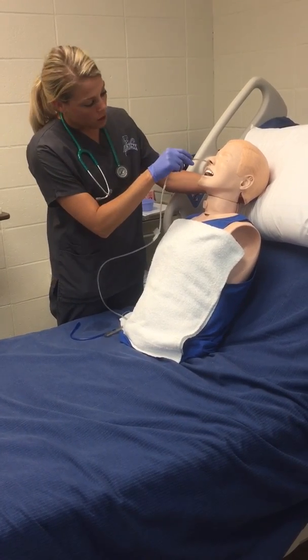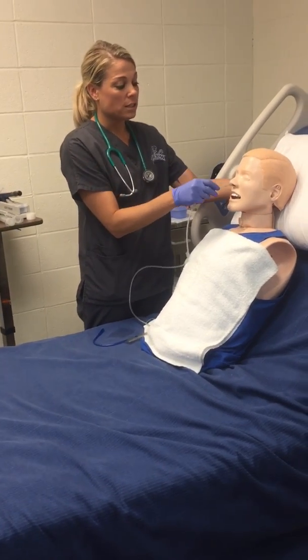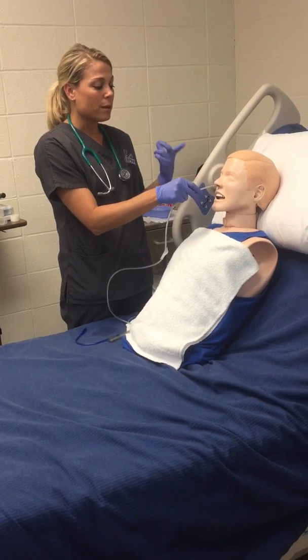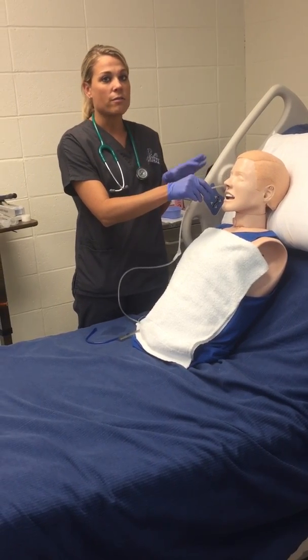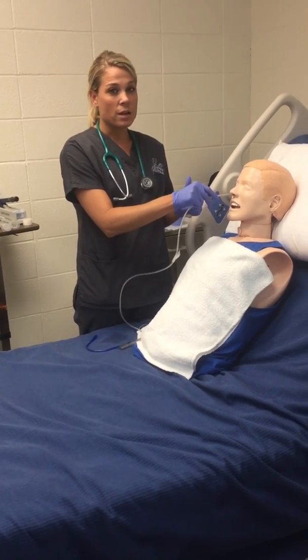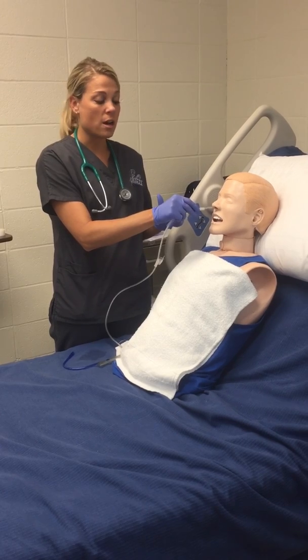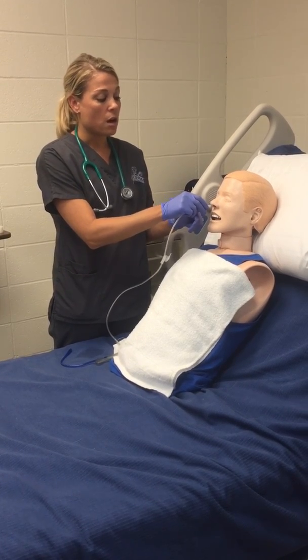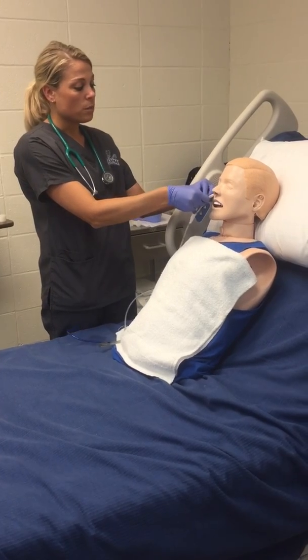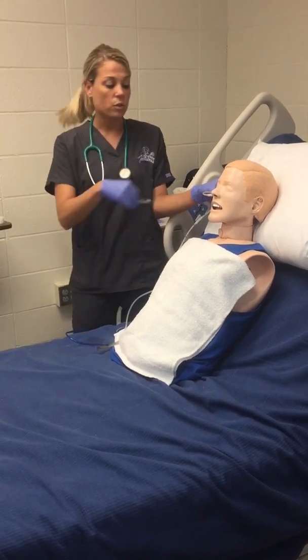Once I reach the oropharynx, I would have the patient tilt his head forward. I would not let go of the tube, but I would get a cup with a straw and have the patient sip on some water and swallow. And as he's doing that, I would advance the tube 2 to 4 inches each time until we finally reach the measurement that we need it to be at. So when we reach that measurement where the tape is at, I'll temporarily secure the tube in place.